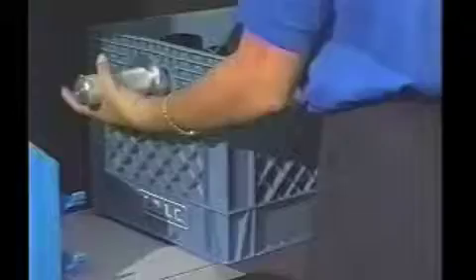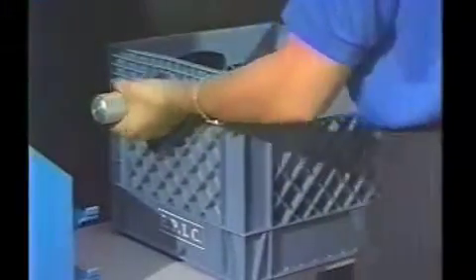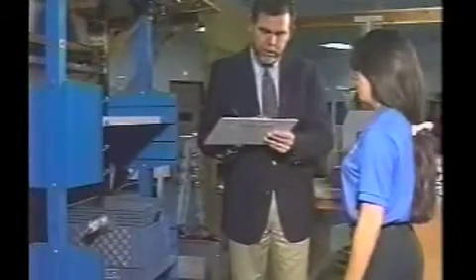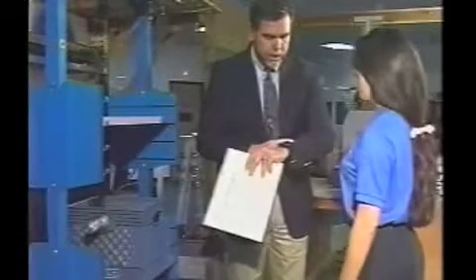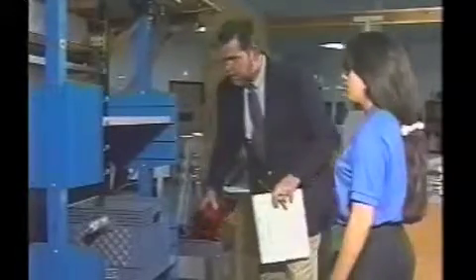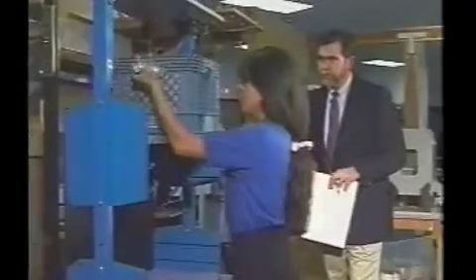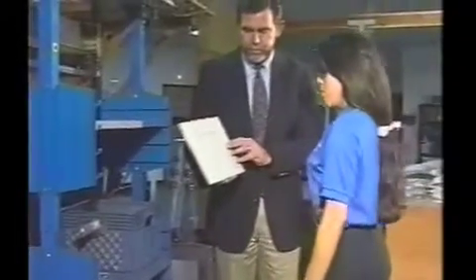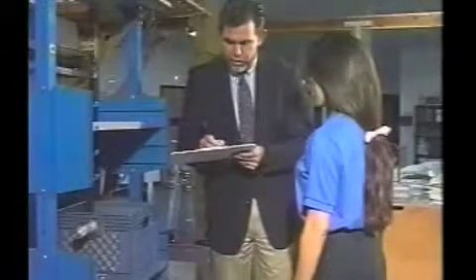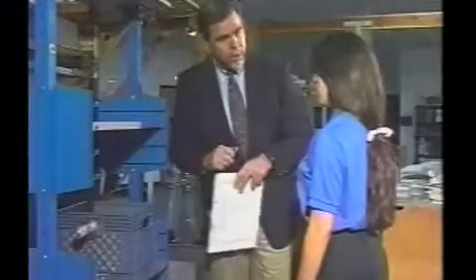There we go. Would you rate that for me, please? [Margaret: I would do.] And can you do that on a safe and dependable basis 8 to 12 times per day? [Margaret: Yes.] Can you handle more weight? [Margaret: Yes.] Would you rate that for me, please? [Margaret: How about a four?] Now Margaret, is that something you can do on a safe and dependable basis 8 to 12 times a day? [Margaret: Yes.] Can you handle more weight? [Margaret: Yes.]